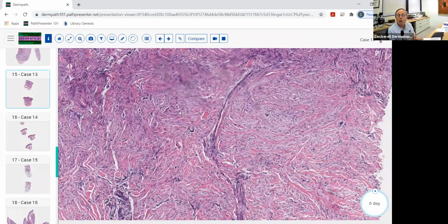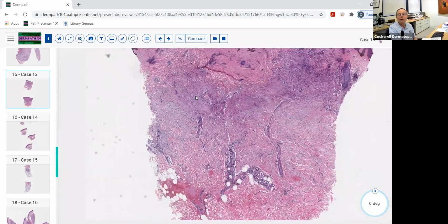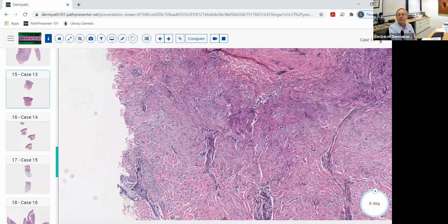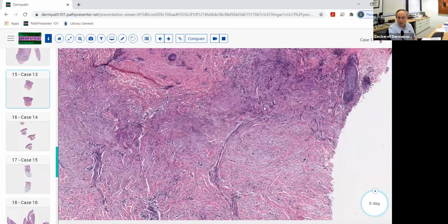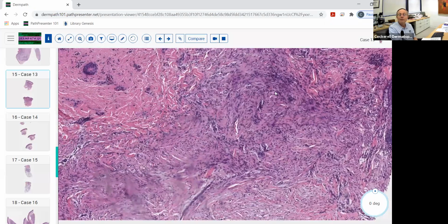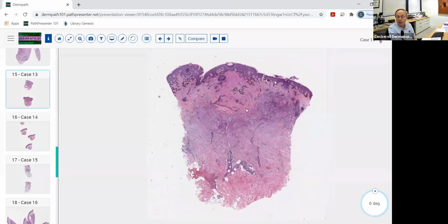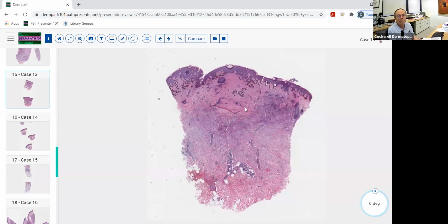We refer to that as a dermatomyofibroma. And basically, that's a good way to think about it. Think of it as almost a dermatofibroma that's just got a lot of myofibroblastic differentiation in it. So the myofibroblasts are so predominant that it almost looks like they're forming smooth muscle bundles here. So it's really a combination, if you will, of a smooth muscle leiomyoma and a dermatofibroma. So this is a so-called dermatomyofibroma. A benign lesion, nothing to worry about. Just another example. And here, instead of having only fibroblasts and histiocytes, you've got myofibroblasts plus histiocytes forming this lesion.